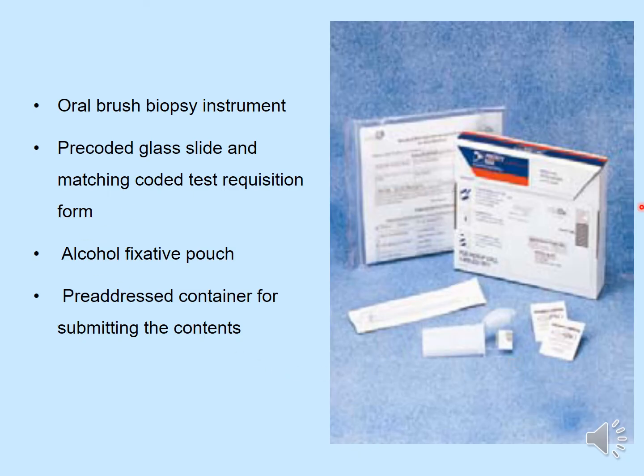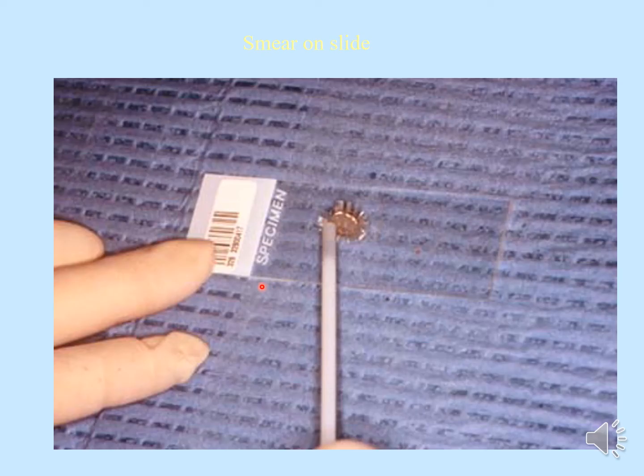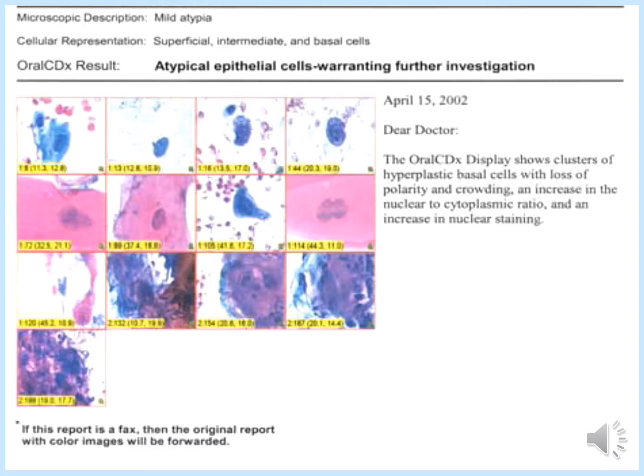So the brush biopsy kit comes as something like this. It has a pre-coded glass slide and a matching coded test requisition form, alcohol fixative, and a pre-addressed container for submitting contents. All you have to do is identify the site, rotate the brush on the lesion to collect the sample, then spread the cells on the glass slide, pour the fixative, and let it dry.